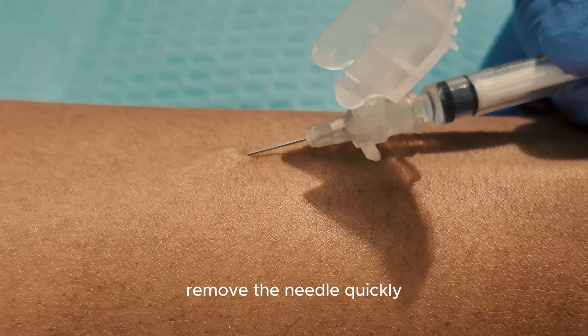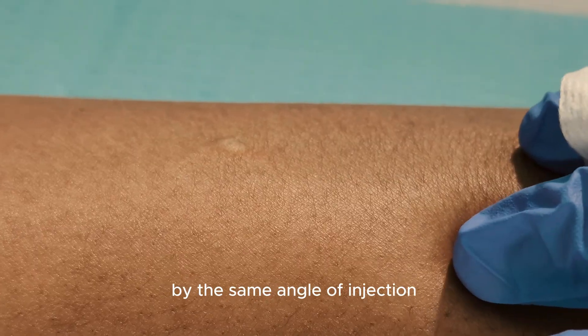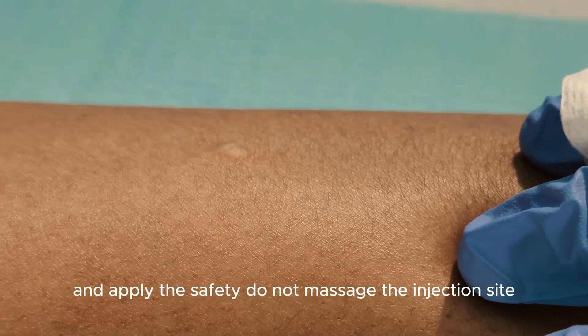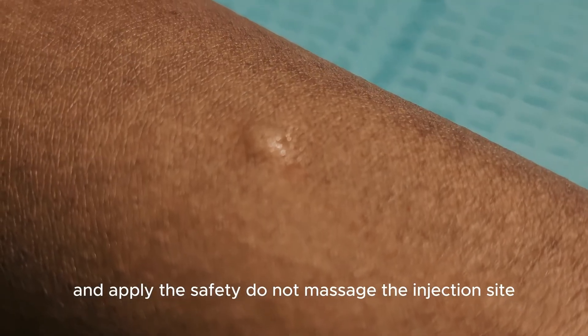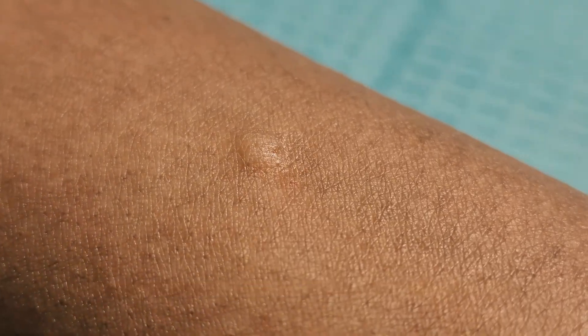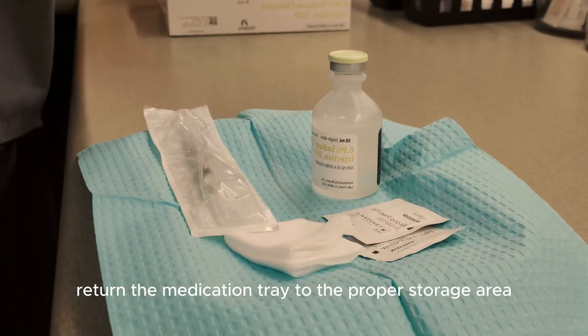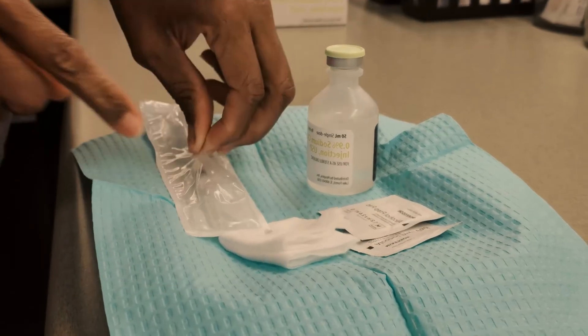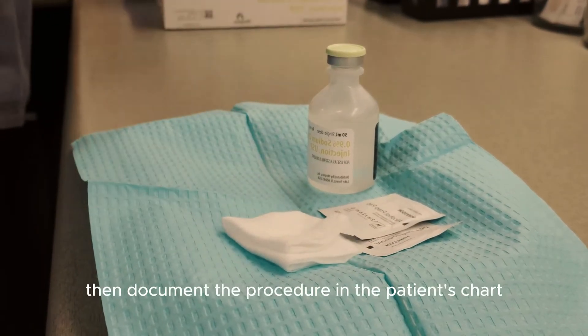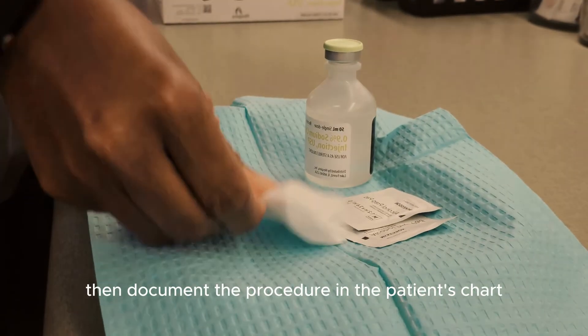Remove the needle quickly at the same angle of injection and apply the safety. Do not massage the injection site. Return the medication tray to the proper storage area, then document the procedure in the patient's chart.